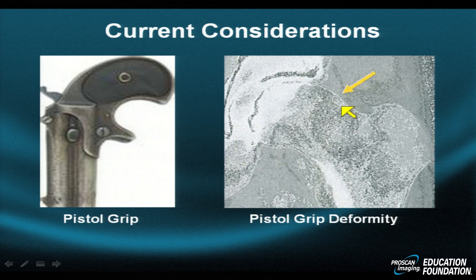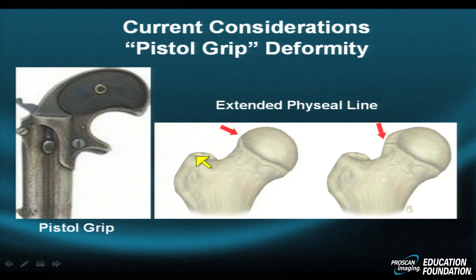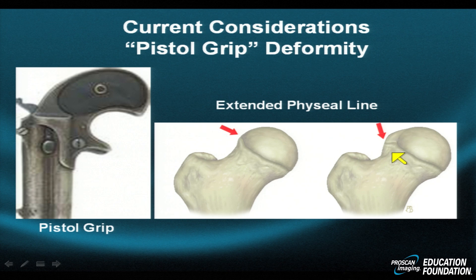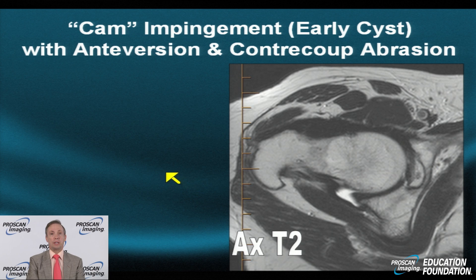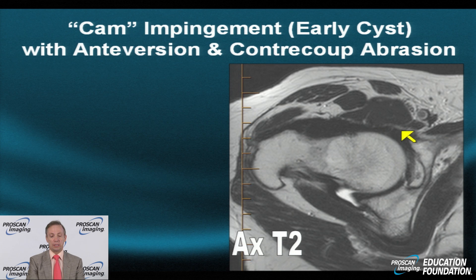This loss of sphericity creates what's known as the pistol grip deformity. Here's a coronal example of the pistol grip deformity versus the normal head, resembling the appearance of a small derringer-type gun. The deformity has an extended, more lateral appearance, creating a rounded, convex-outward shape. With repetitive flexion and varying degrees of adduction, this non-tapered femoral head-neck junction rams into the acetabulum.